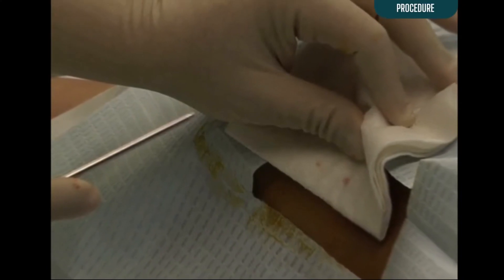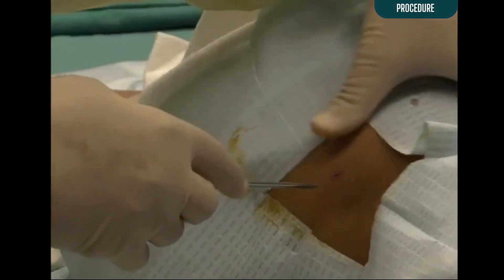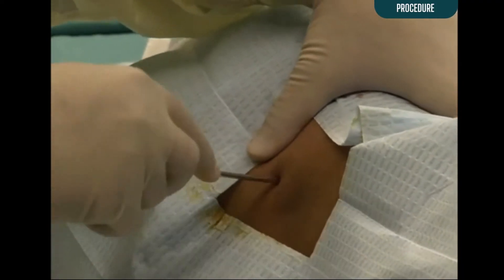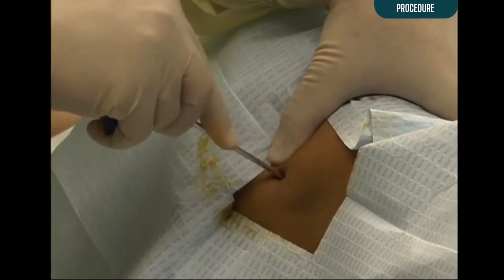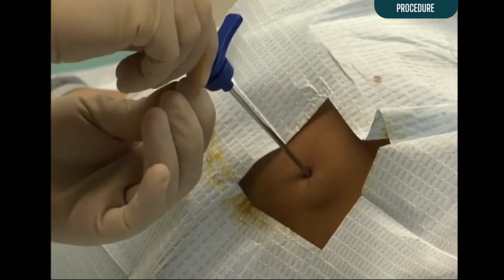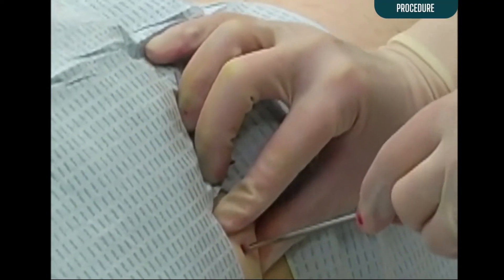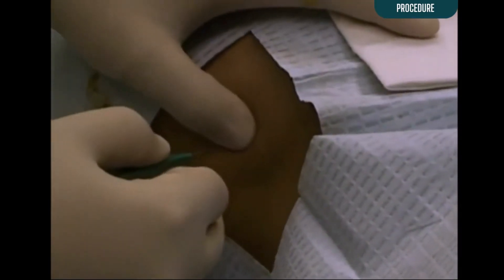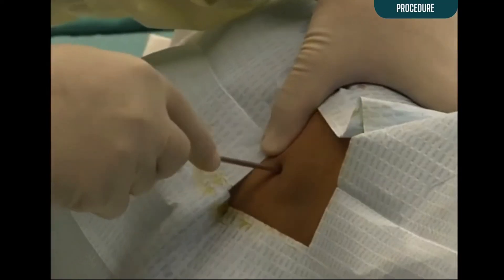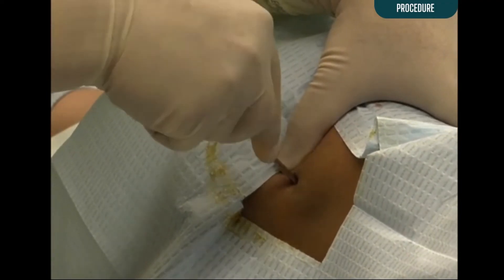Bone marrow biopsy is often done following a bone marrow aspiration. Maintaining sterility, obtain a bone marrow biopsy needle. Holding the needle between your palm and index finger, insert the needle into the patient's skin and advance until it touches bone. If an aspirate has been performed, the same entry site through the skin may be used for the biopsy. However, a skin incision may be indicated if only a bone marrow biopsy is being done, or after an aspirate to allow for entry of the larger biopsy needle. While applying steady pressure, advance the needle with its stylet in place into the cortex by rotating back and forth.